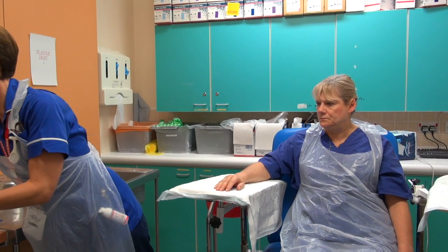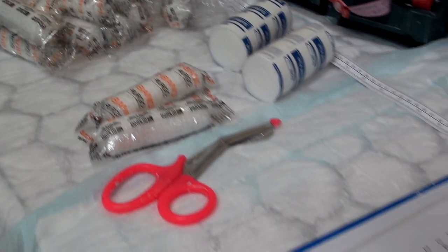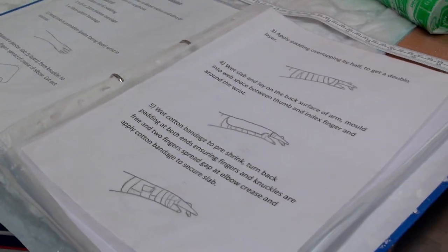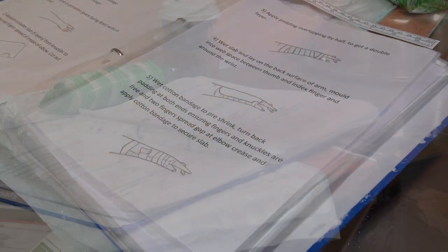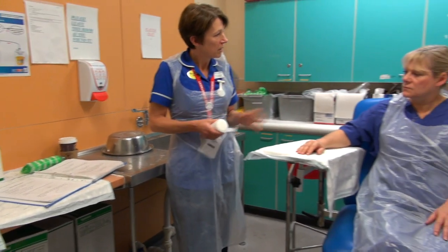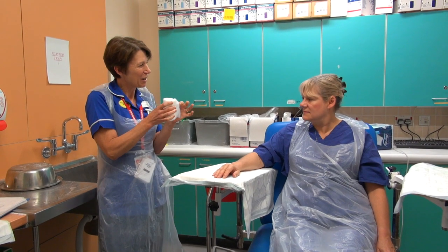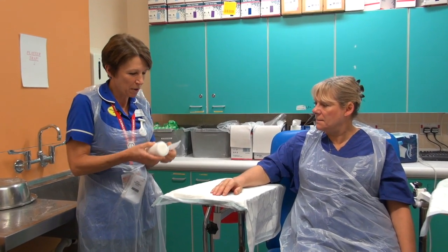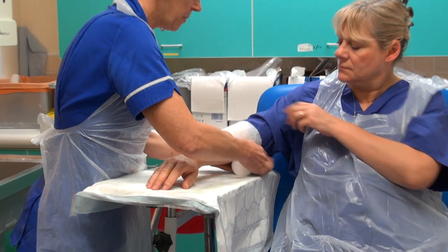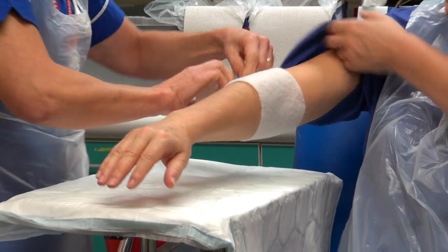So what I need is a roll of padding. Now all our measurements in our folder are based on the average adult size, but we can adjust these — so if we're plastering a child or a larger adult, we can change the sizing. I'm going to use a 10cm soft arm padding today. I'm going to put the padding on first, starting just above the elbow, and I'm going to put two layers around the top so we have a nice soft turn back.